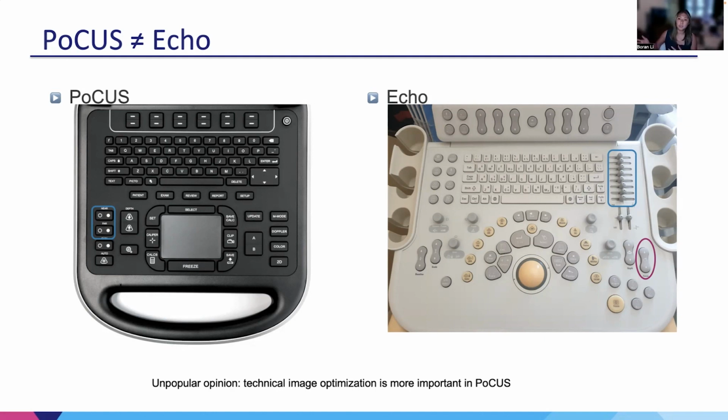If you can manipulate the picture afterwards, then it kind of doesn't matter what you take in the moment because you can make it look good afterwards. But if you can't, then you have to make sure that you're getting a good picture to begin with, which is why I think it's actually important for us to be really good about trying to get the best image by using the best technique.